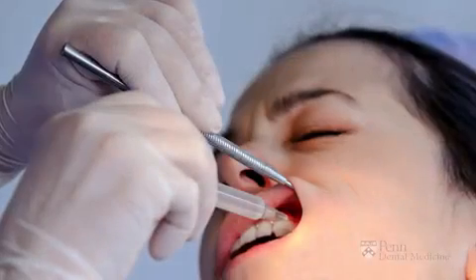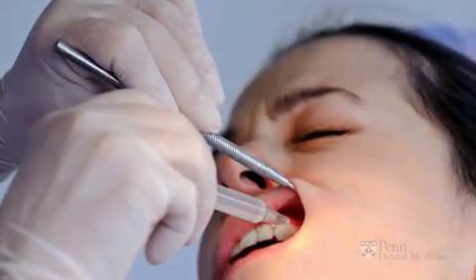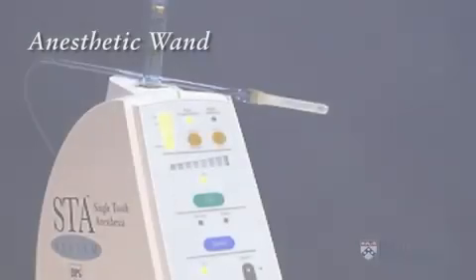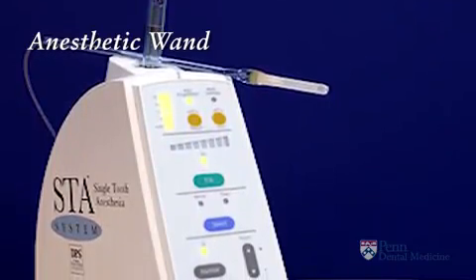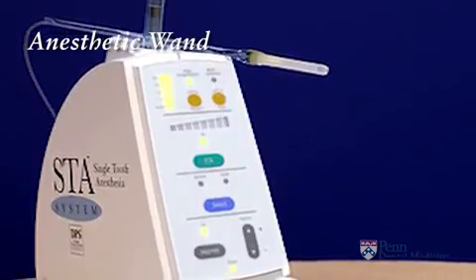One of the least favorite procedures in the dental office is the injection of the local anesthetics. Actually, the pain is caused not by the anesthetic itself, but rather by the pressure from the injection of the liquid anesthetic. The anesthetic wand uses computer-regulated slow and gentle flow of anesthetic to reduce the pain of injection.